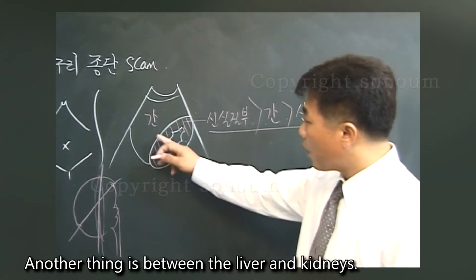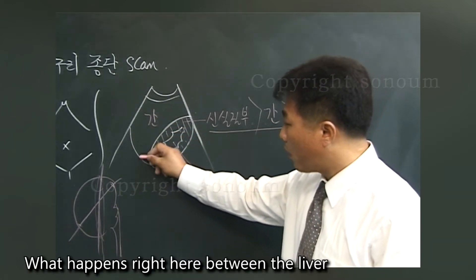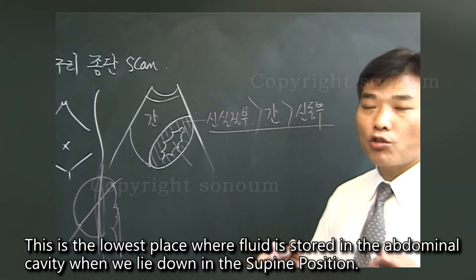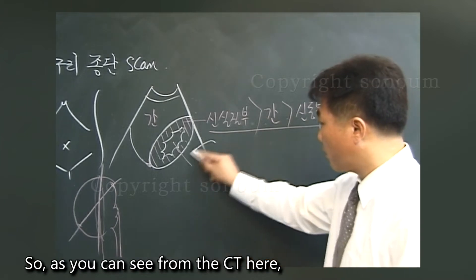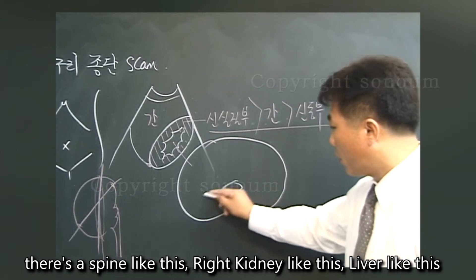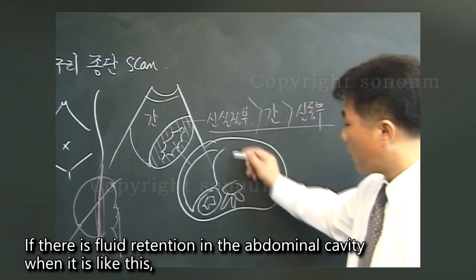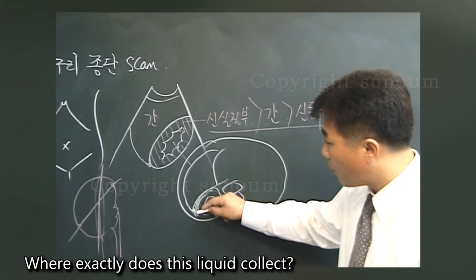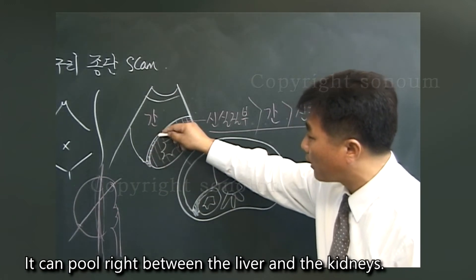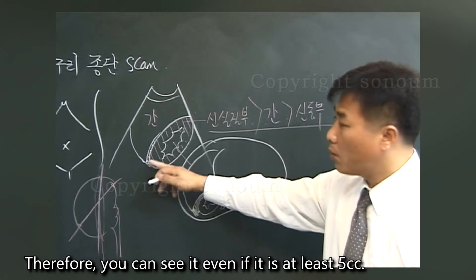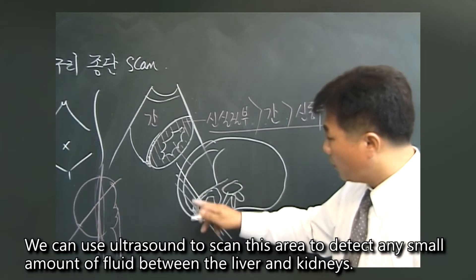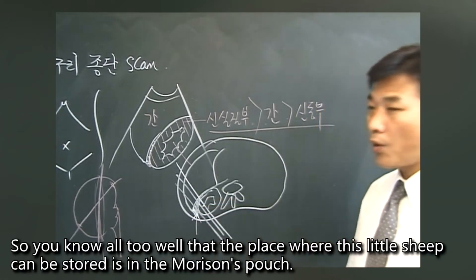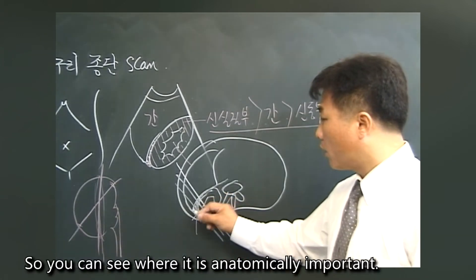Here's another important thing to know about echo. Between the liver and kidneys, what happens right here is the hepatorenal space. This is the lowest place where fluid is stored in the abdominal cavity when we lie down in the supine position. There is the spine, the right kidney, and the liver. If there is fluid retention in the abdominal cavity, it comes to the right area. The fluid collects right between the liver and the kidneys. You can detect it even if it is as little as 5cc.